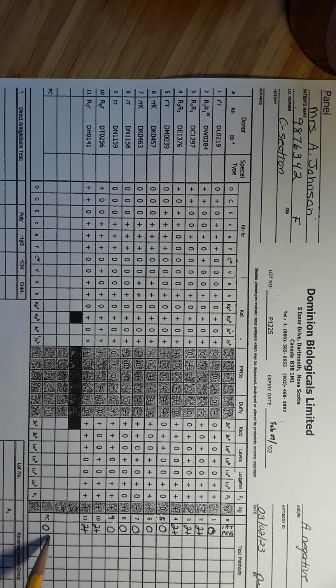If this is positive, we may be dealing with a patient that has an autoantibody or an autoantibody and an alloantibody. So obviously for your first antibody ID, I'm not throwing an autoantibody at you guys. So this patient does not have an autoantibody. The antibody showing up in their plasma is an alloantibody. It's been produced against an antigen that they lack, that they have been exposed to through transfusion or pregnancy.